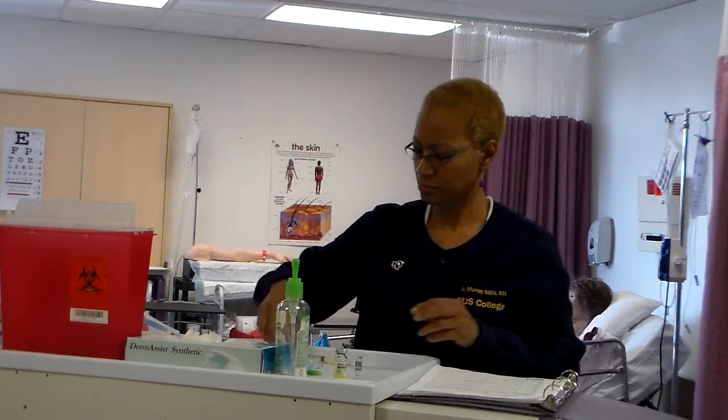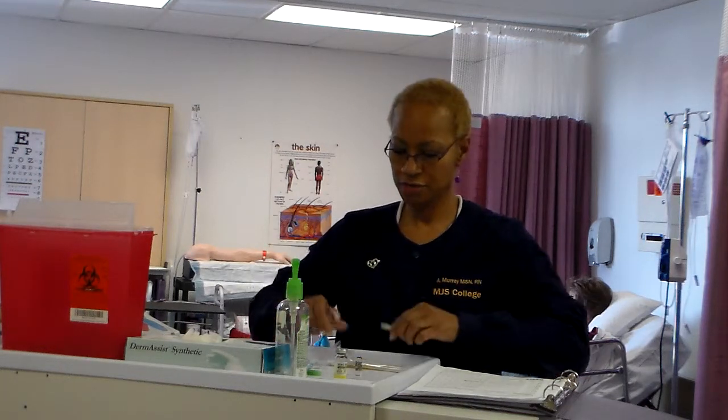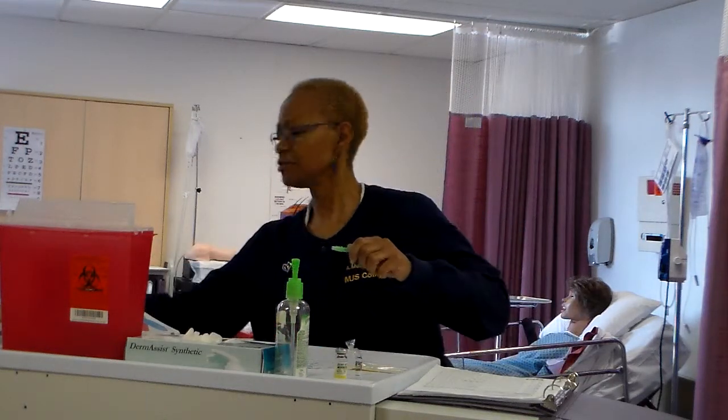Draw up the medication quickly using a filter needle long enough to reach the bottom of the ampule. So you're going to remove the needle that's on here and attach your filter needle, a nice long needle. You can actually invert your ampule and you'll see that the fluid doesn't come out. You're going to insert your needle into your ampule and withdraw your medication.